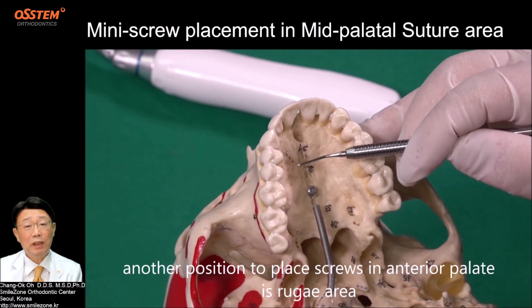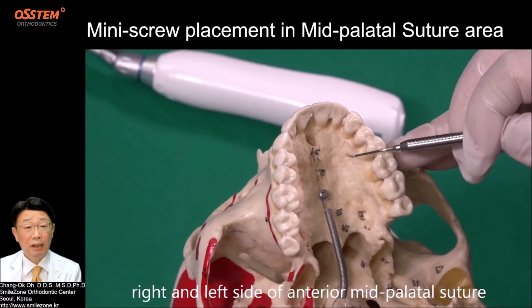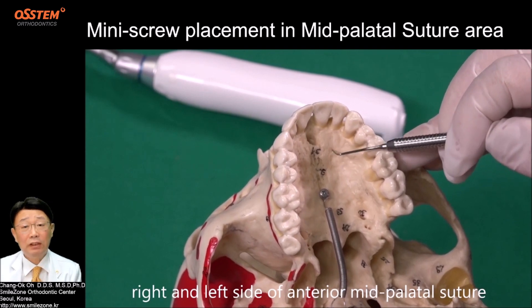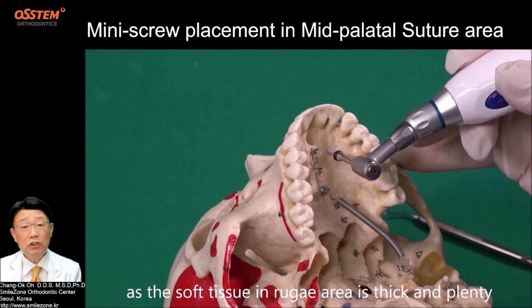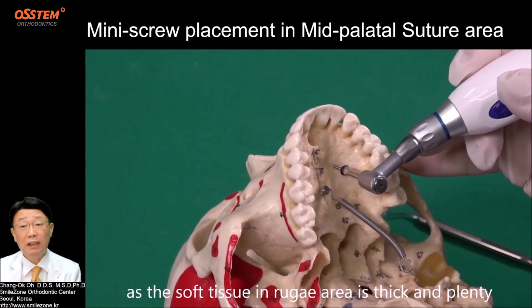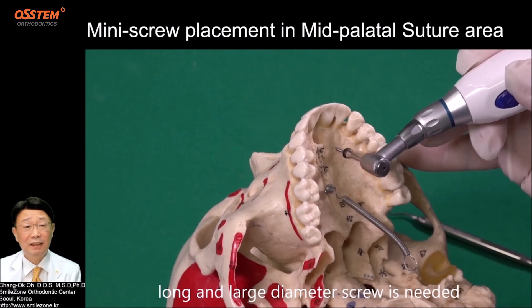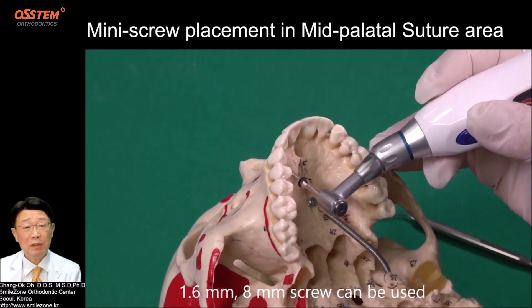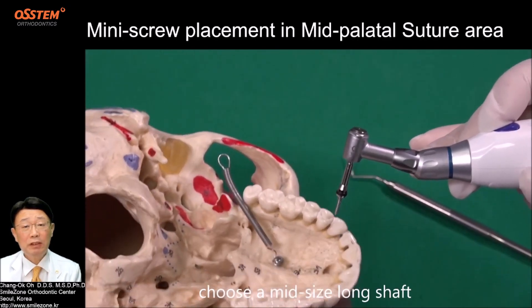Another position to place screws in the anterior palate is the rugae area, right and left side of the anterior mid-palatal suture. As the soft tissue in the rugae area is thick and plentiful, a long and large diameter screw is needed — a 1.6 mm, 8 mm screw can be used. Choose a mid-size long shaft.